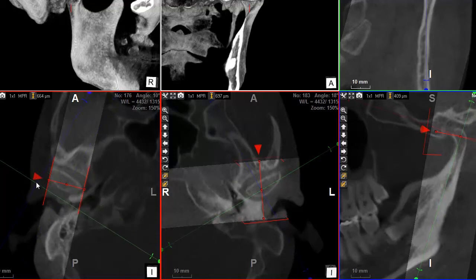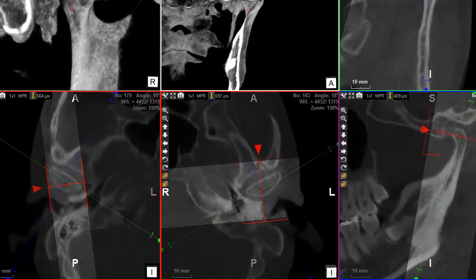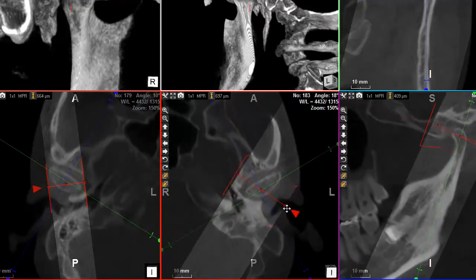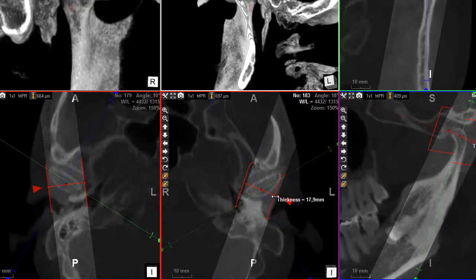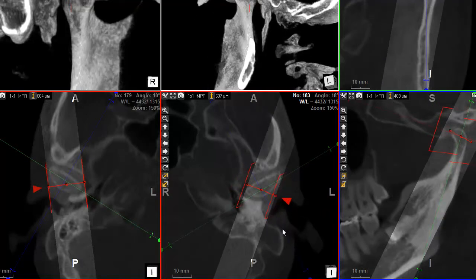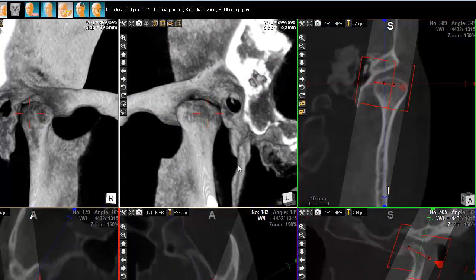There we go. Oops, I changed the view. No, I shouldn't have changed this one, but rather this one. Look at that. I have here a very nice idea of what's happening. Let's do the same more or less here. Let's first change the angle like this and select. Well, Thin Slab, as you can see, enables you to have a slab, like a piece of bread of your patient, and that enables you to clearly select what you are interested in.